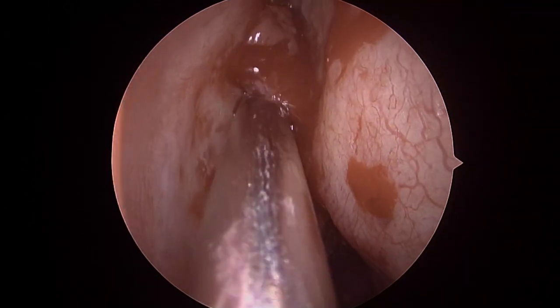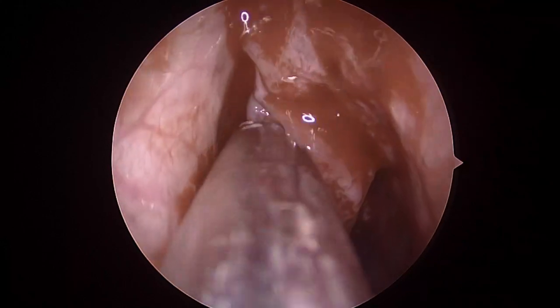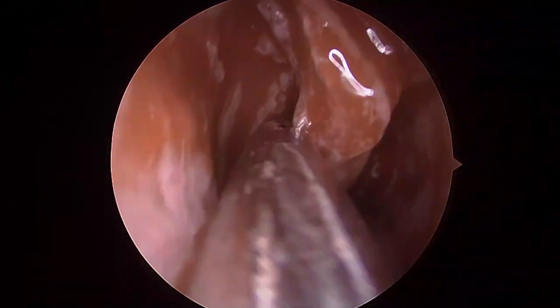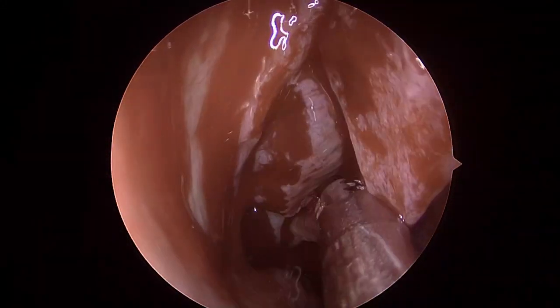So I would like you to appreciate how the cutting edge of the debrider changes directions, and I haven't traumatized any part of the lateral nasal wall or the septum, which ensures that there are no synechiae or adhesions formed later on.